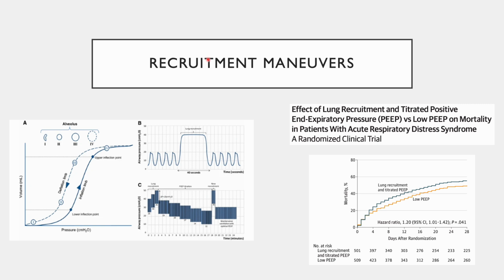Taking things beyond just a higher PEEP, lung recruitment maneuvers such as the 40-40 method and staircase recruitment methods push the boundaries of alveolar recruitment with a temporary use of supraphysiological pressures. They were based on the premise of lung hysteresis, where a higher pressure is needed to open up a collapsed lung unit than to keep it open, primarily because of surface tension considerations. As such, these methods used high sustained pressures to induce recruitment before being brought down to maintain opening.